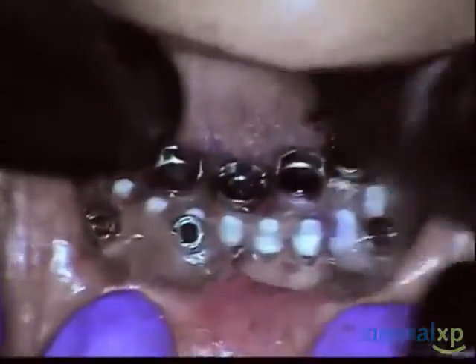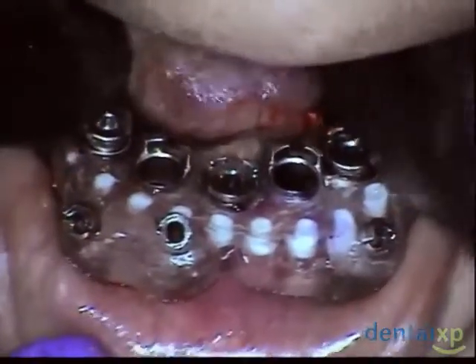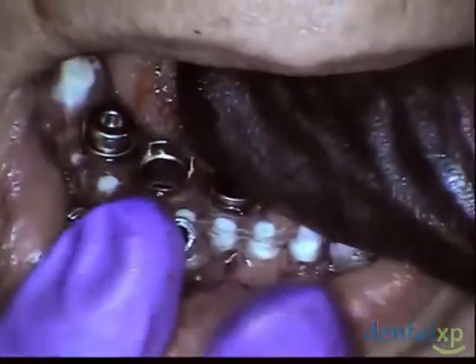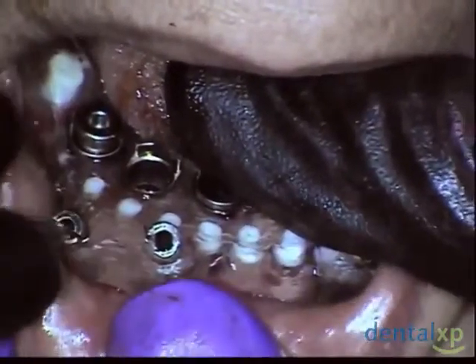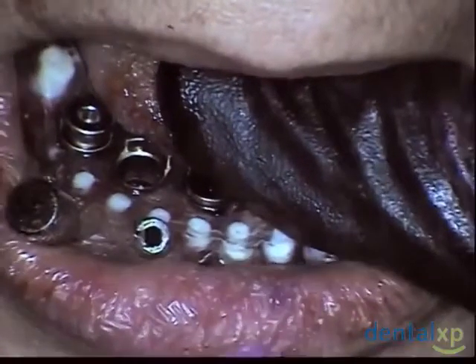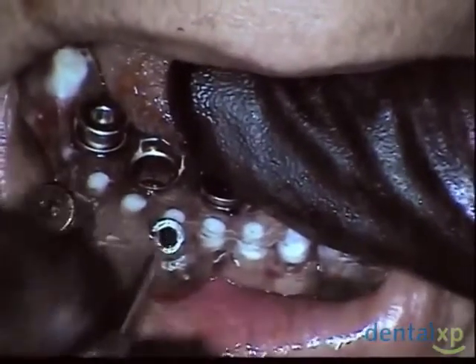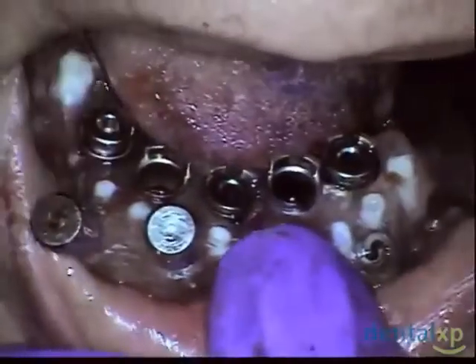If this were type 2, 3, or 4 bone, we may not go to depth, because then, as you're going to see on the upper, we would allow the implant to be our tap, which would condense the bone like a sponge, and therefore the bone around the implant interface would be much denser than the bone in the rest of the maxilla.